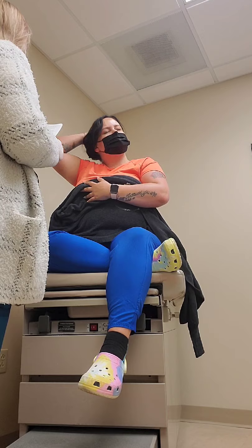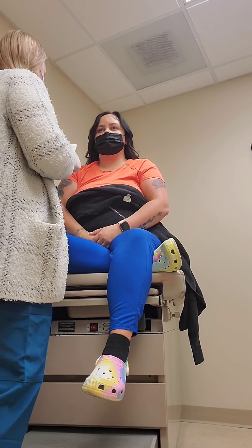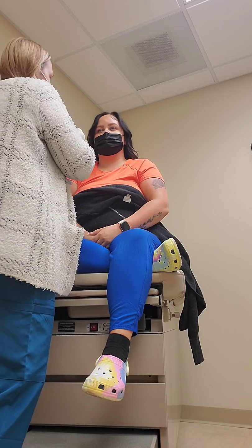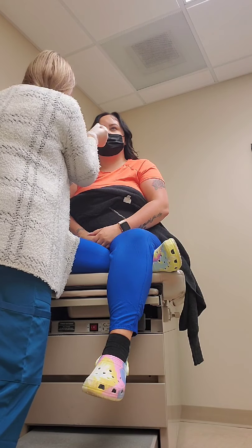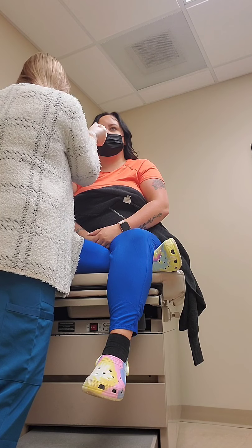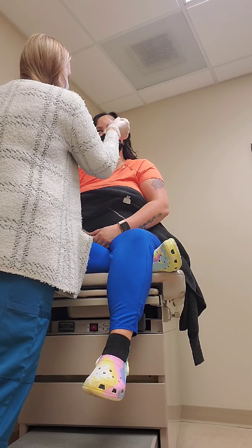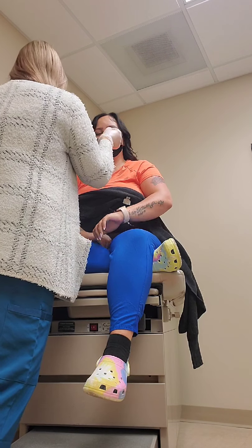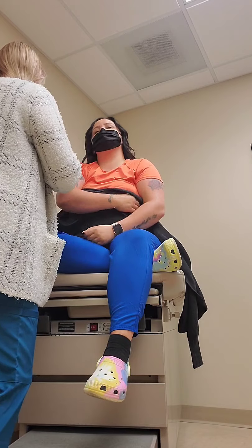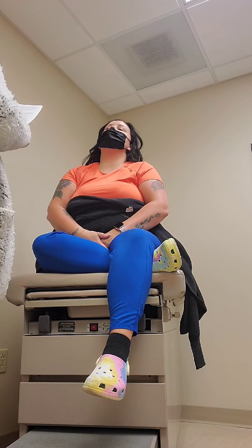of the eye. Okay, so with your ophthalmoscope, you want to come within about a thumb's width of the patient's eye, and you want to take a look into the back of their eye. Okay, and you're gonna do that with both sides. Okay, the ophthalmoscope in that eye, and then the other one. The next thing we're gonna do is test auditory acuity.